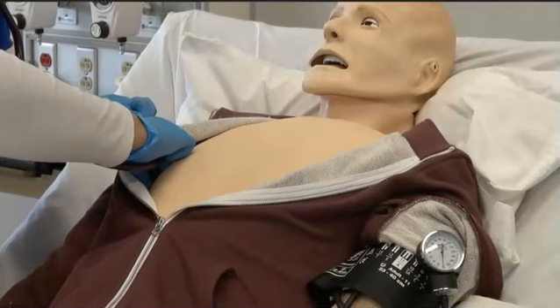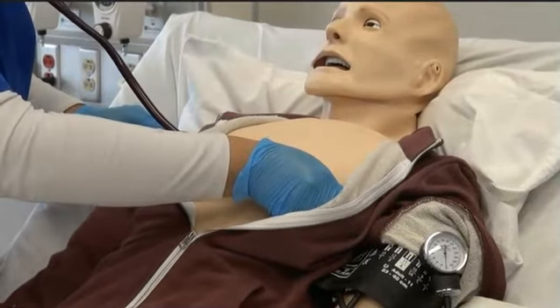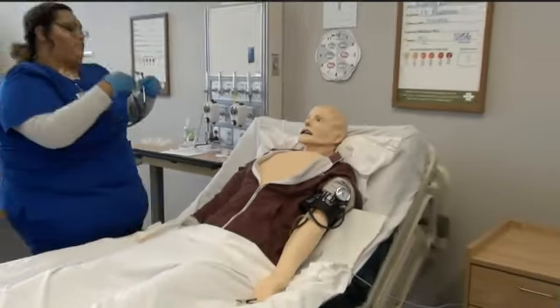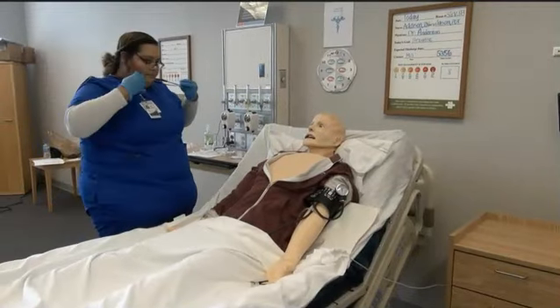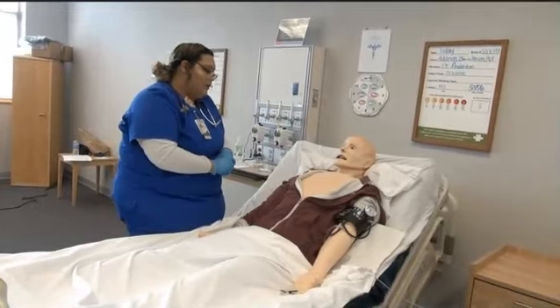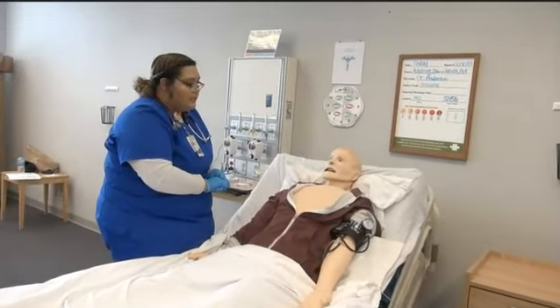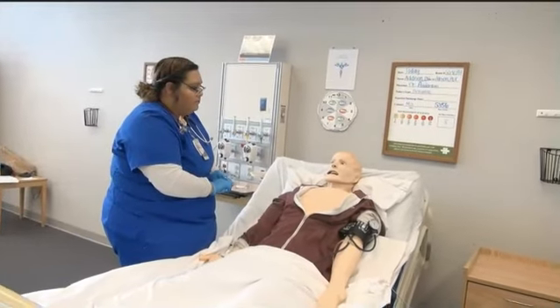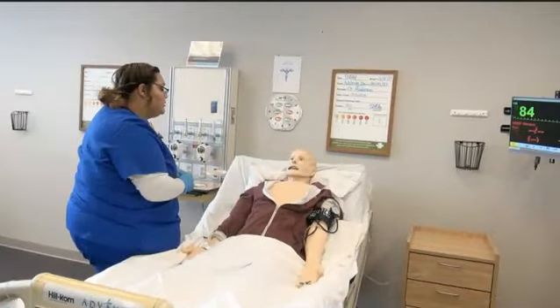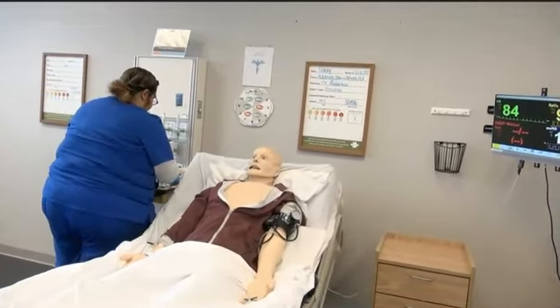Please note how well the respiratory therapist communicates with the patient after her assessment. Okay. So your heart rate was perfect, your respiratory rate is good. Is there anything I can do for you at this time? No. Okay. Thank you. I am going to rinse off your nebulizer so I can be ready for your next treatment, okay? Thank you. You're welcome.